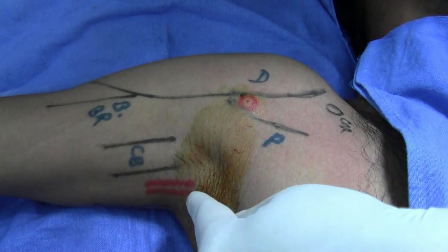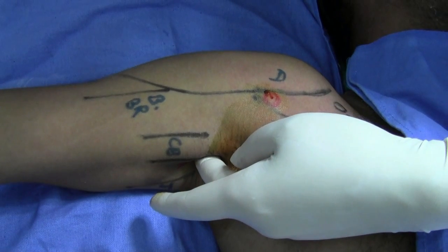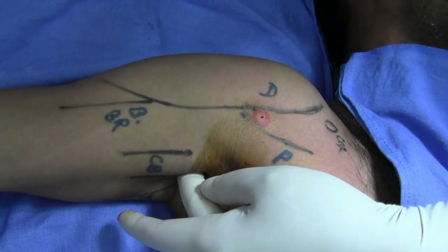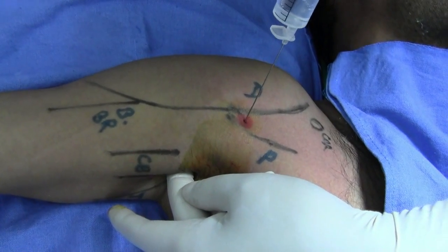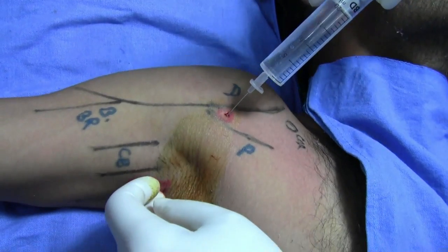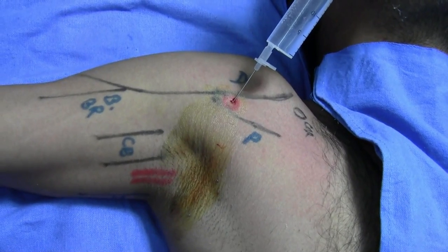Keep the index finger at the axillary artery here and make sure you are able to palpate it. Now use the middle finger to palpate the artery from here. Insert the needle from the previously anesthetized point and move towards the artery. He felt paresthesia — ideally our aim is not to elicit paresthesia.